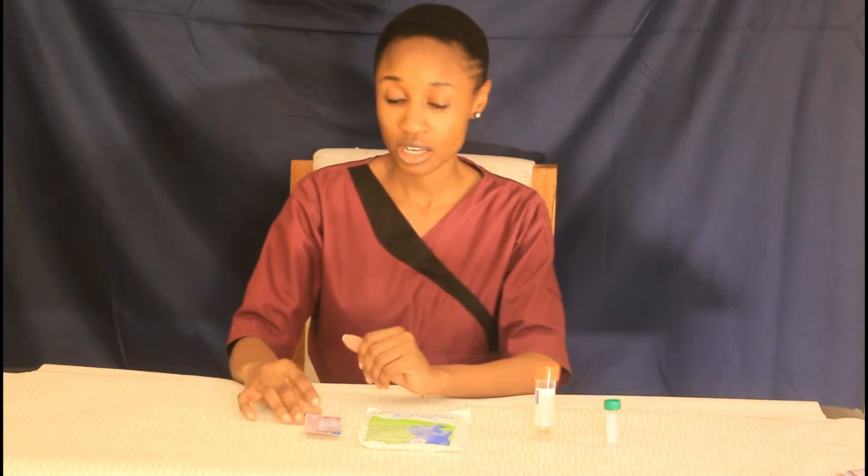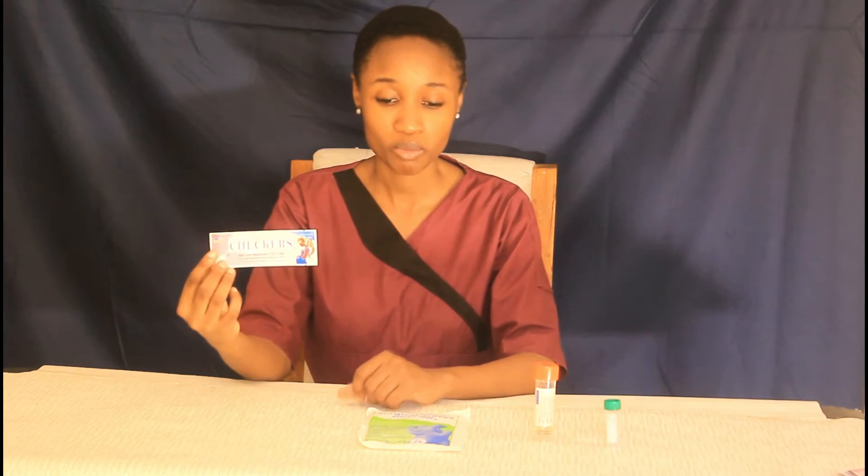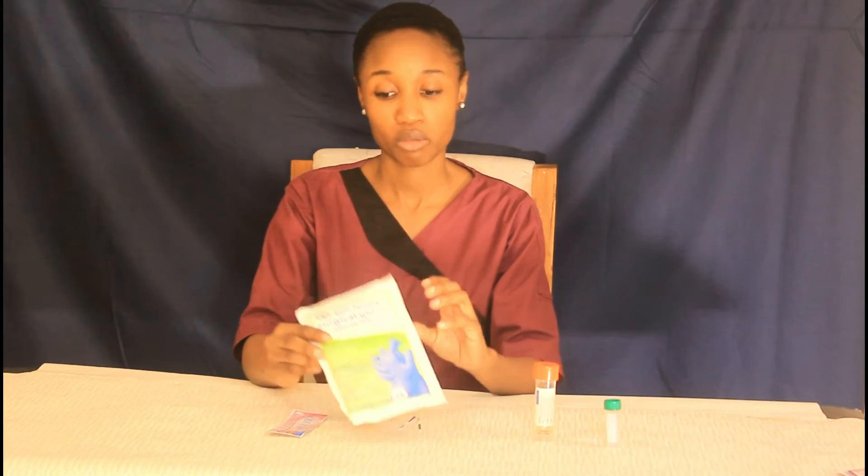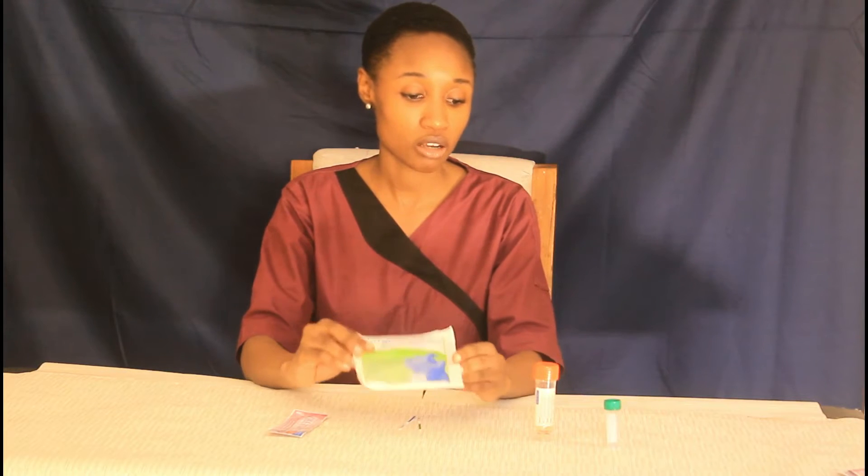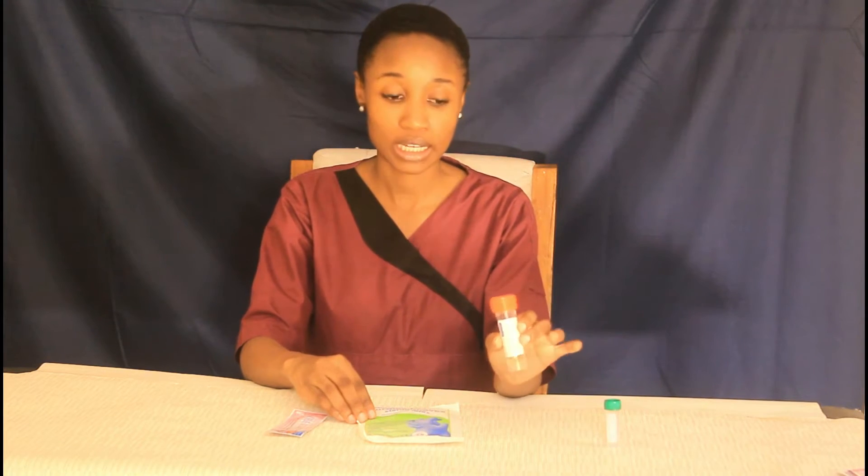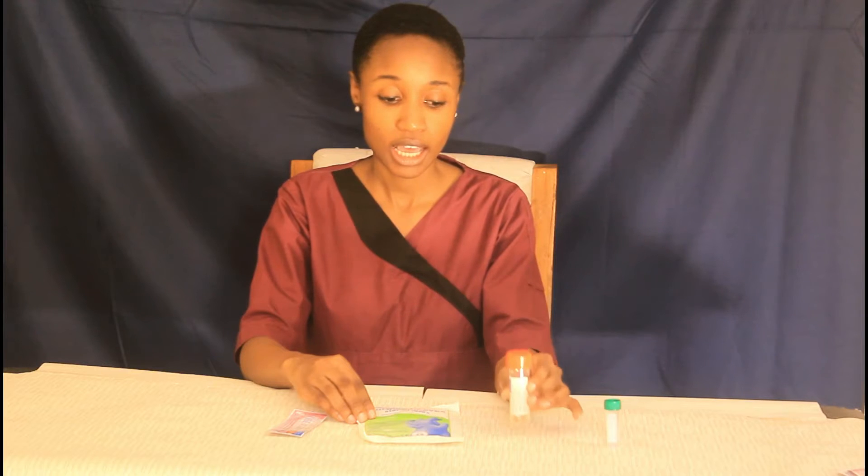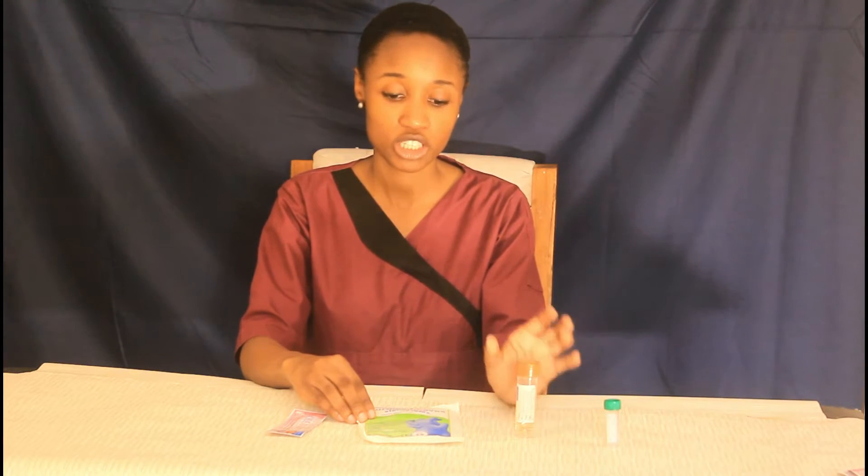So to do a pregnancy test at home you will need to have a pregnancy test strip, you can use gloves if you're in a clinical setting, your early morning urine and a sample to place it in and a timepiece so that you can check the time.